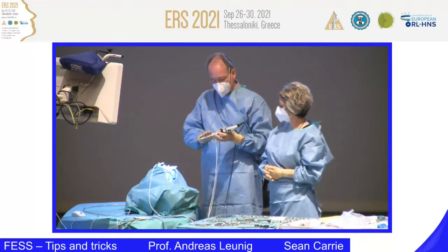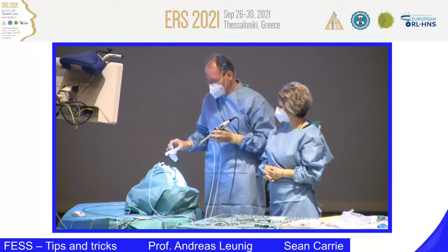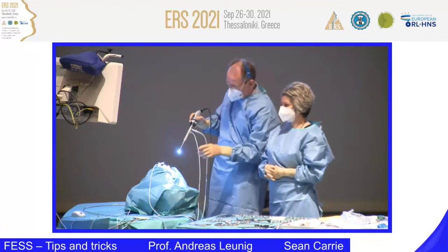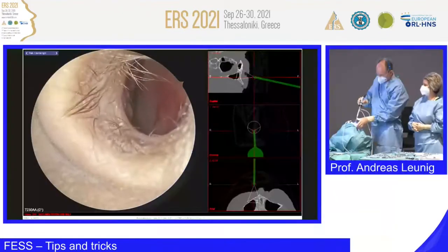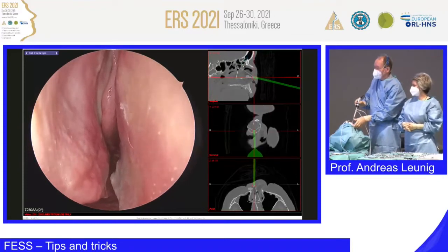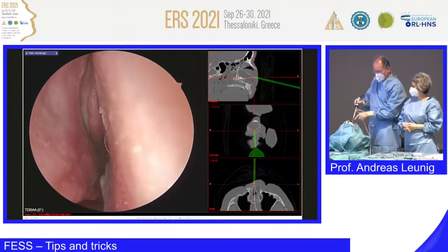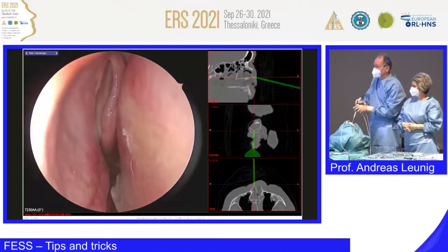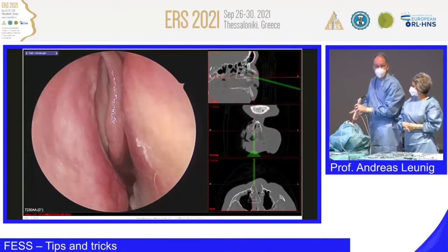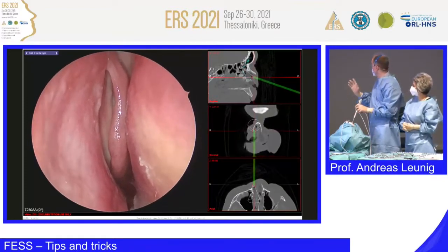So when you use the endoscope and the camera to introduce it in the nose, now we're coming slightly to the surgical procedure itself. I'm not sure if you can see it in this corner, but very important is to hold the endoscope like I showed you. I go in, we are passing the nasal valve on the right side of the specimen, and you press your endoscope in the upper part of the vestibulum nasi, and you have a very stable situation to work under the endoscope. It's very important, otherwise you don't have the space. So keep it quiet, don't shake. I hope I'm not shaking, but I think the picture should be fine.